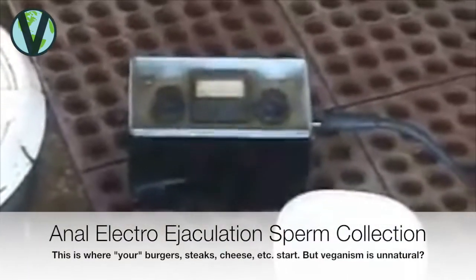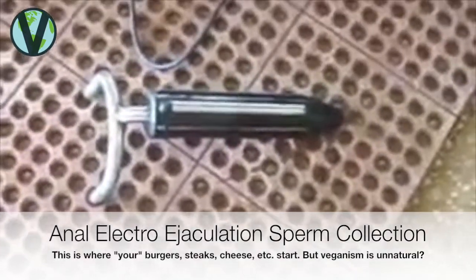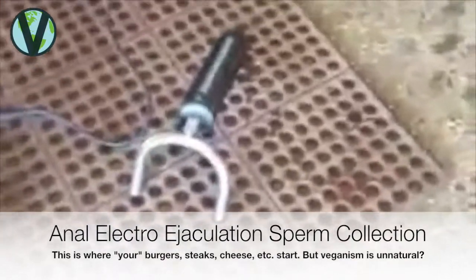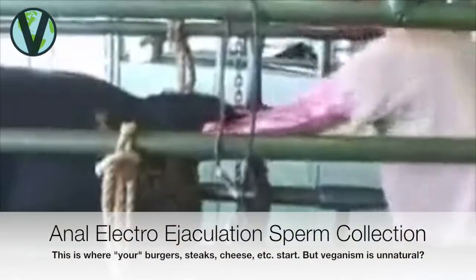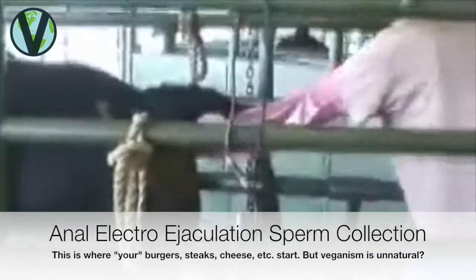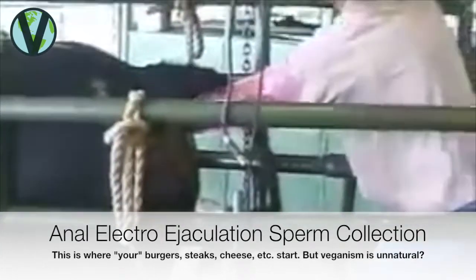We utilize an electroejaculator, where here's an example of the probe, and you can actually see the silver bars which supply the current, which would be placed downward on top of the muscles within the bull's pelvis that would stimulate the contractions to bring semen up.